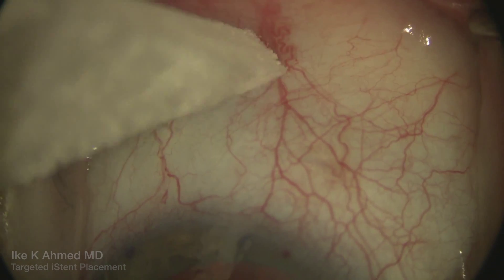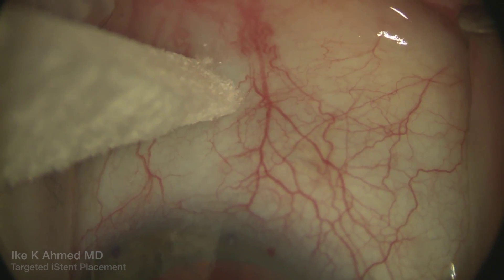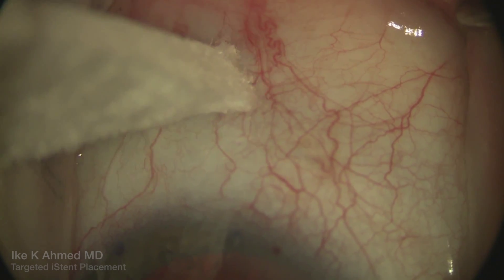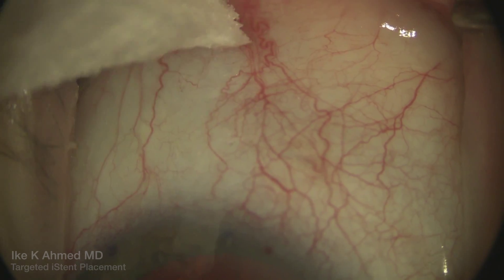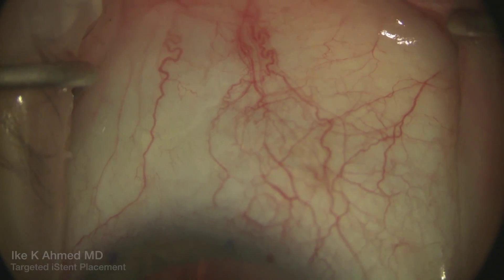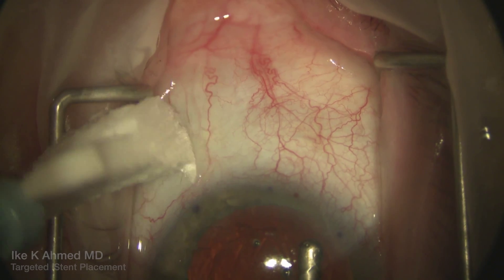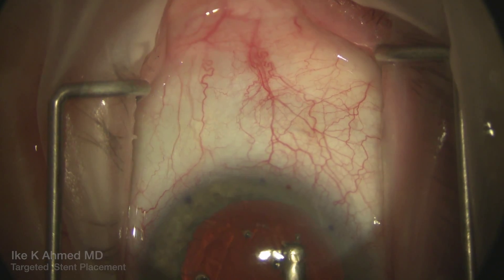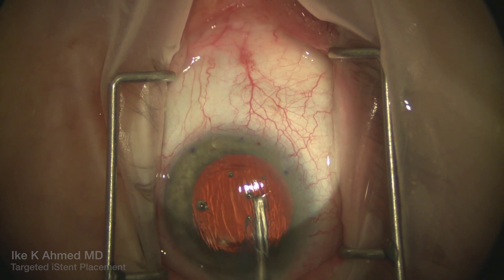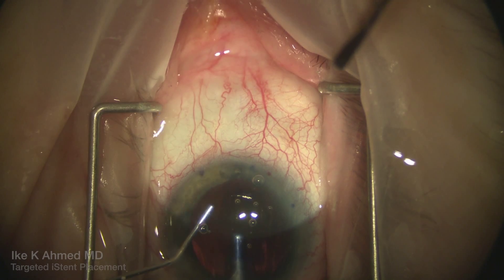The idea behind the aqueous veins is that there are only a few that emerge from the canal, and likely only a couple are visible on biomicroscopic examination. The idea is to look for these veins and place these devices in that area, as these veins have high capacity and high flow rates, and they also connect to some of the surrounding episcleral veins.